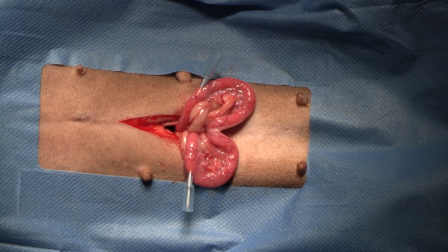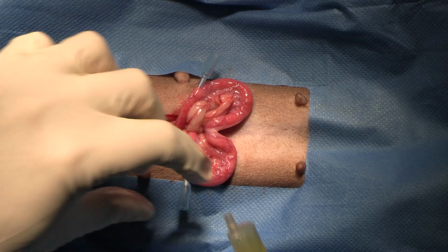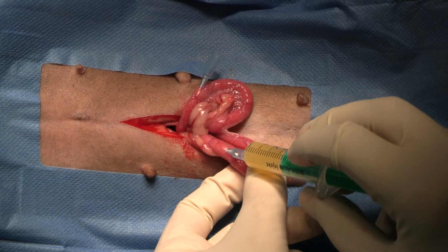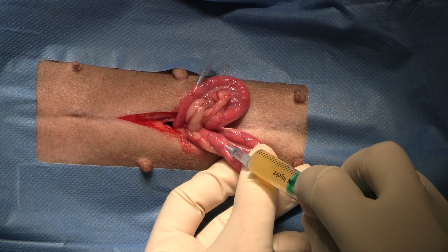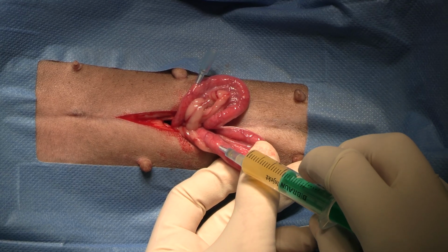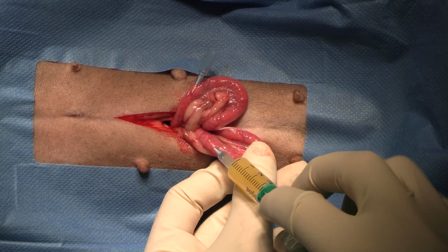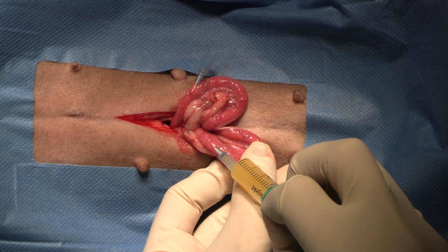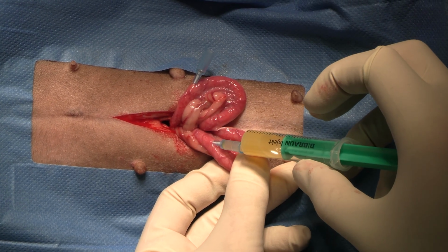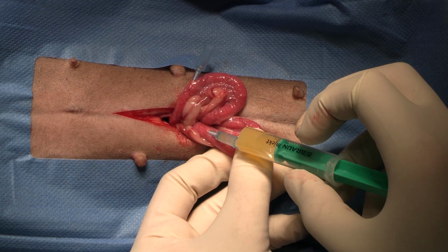We now grab our semen. We connect our semen very firmly to our catheter. And we slowly inject. Again, the semen, there shouldn't be any resistance. If you're in the wrong place, if you're not in the lumen of the uterine horn, you will get resistance. Other ways of checking is I can feel, I'm kind of pinching off the uterus with my finger and I can feel that fluid coming back and ballooning it.